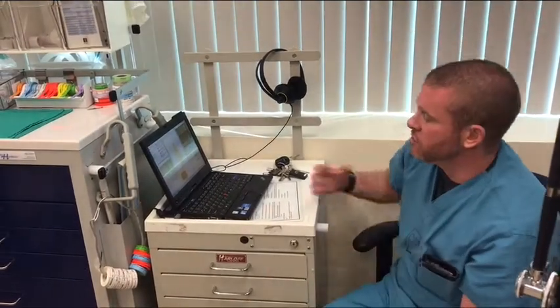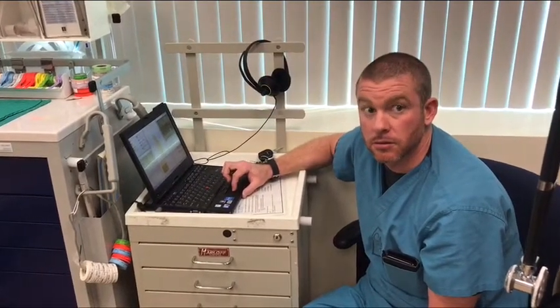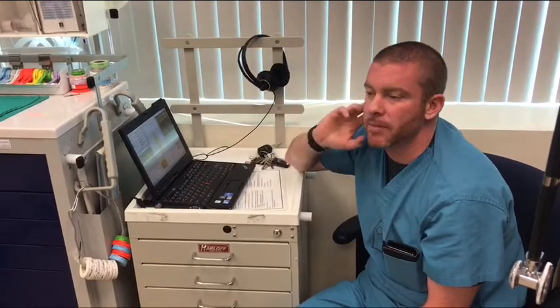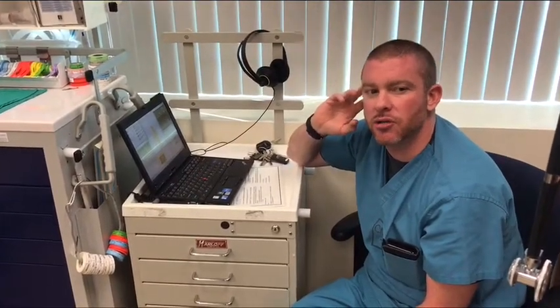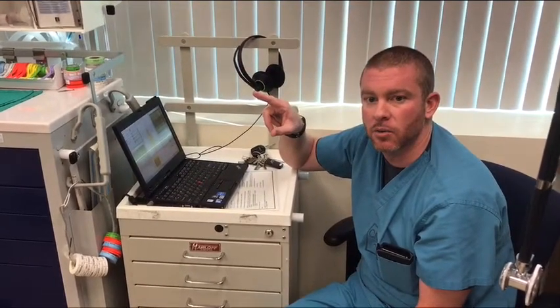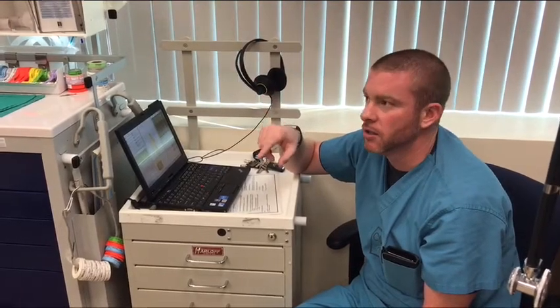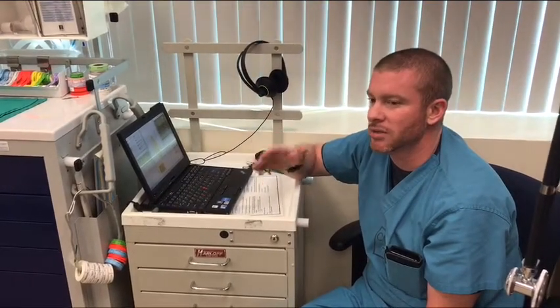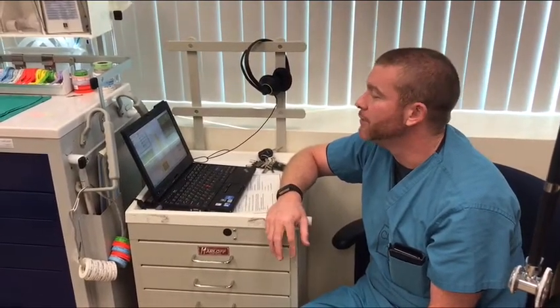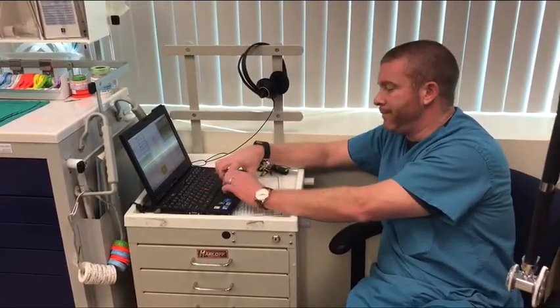What are you listening for at incision? When I say listening, guys, I'm not necessarily listening for the surgeon. I'm listening to that monitor. What do you hear in the background right now? That's the heart rate. So at incision, if the patient was lightly anesthetized, what would I hear? I would hear that going faster. You would hear tachycardia. So we don't hear any tachycardia, so you must be good, right?